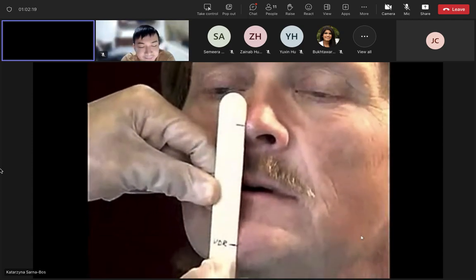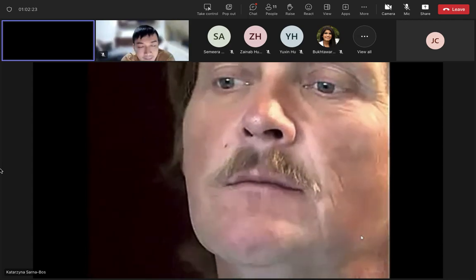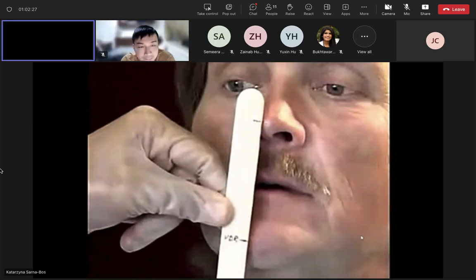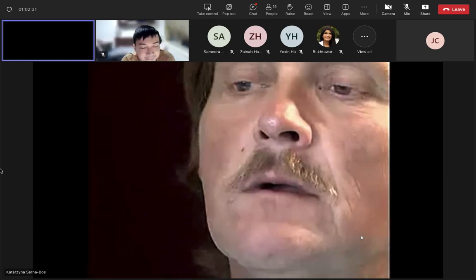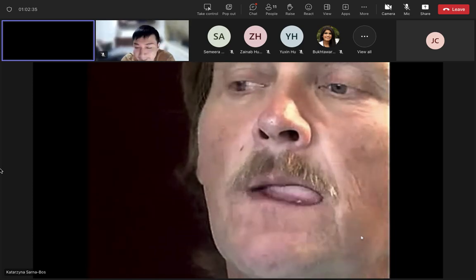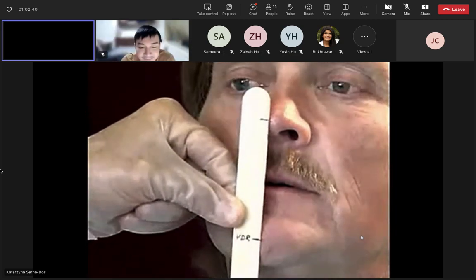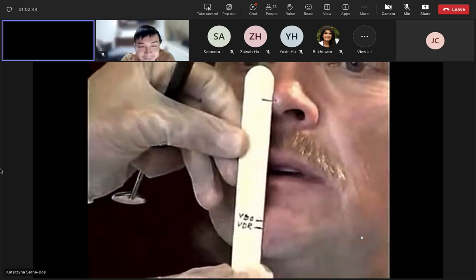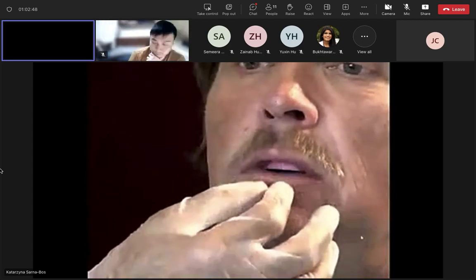Only maxillary record base and occlusion rim inserted to provide lip support. Mark the tongue depressor blade 3 mm short of the vertical relation of rest.